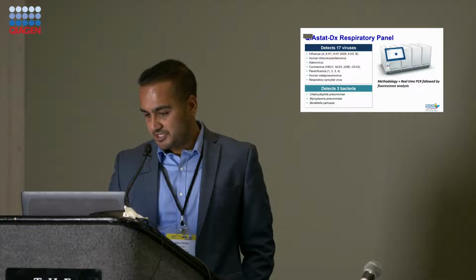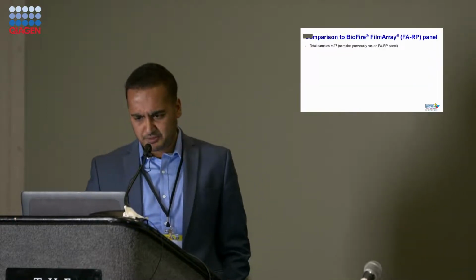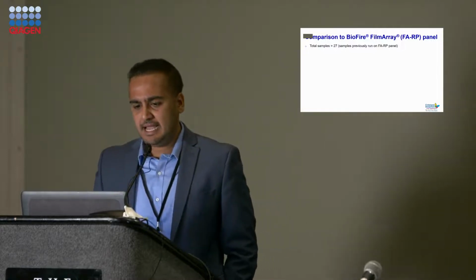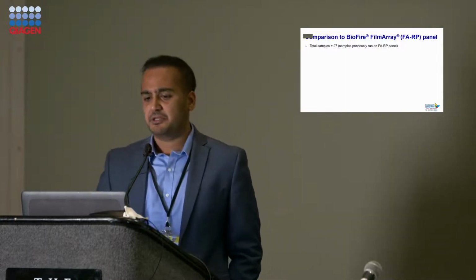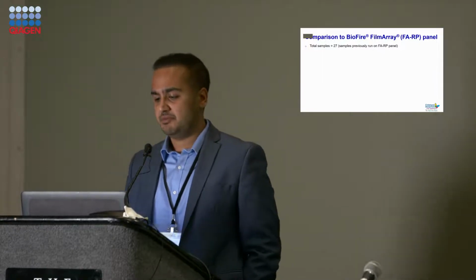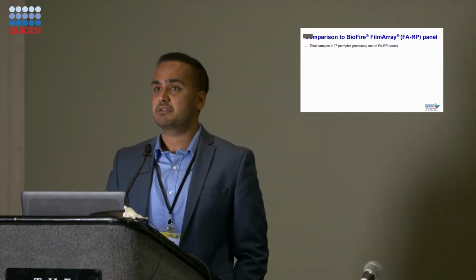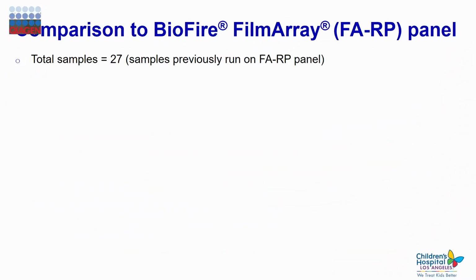So for our study, we tested a total of 27 samples. And as I mentioned earlier, the current standard of care at our hospital is the BioFire FilmArray respiratory panel. So all of these 27 samples were previously run on the respiratory panel.